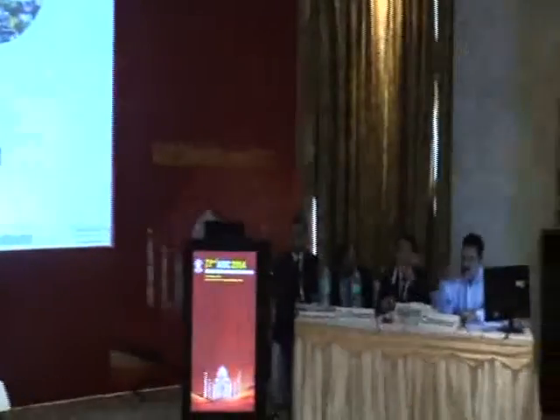Thank you. Do you have any opacification between the two lenses? No, sir. Opacification was seen mostly in cases where both IOLs were implanted in the bag. But the Sulcoflex IOL is a piggyback lens that's implanted in the sulcus. So if at all, the primary IOL might have a posterior capsular opacity, but there is no chance of an interlenticular opacification due to the design of the IOL itself. Can you use YAG then and clear it up? If it is interlenticular, unlikely, I would think. But posterior capsular opacification for the primary monofocal IOL, yes, definitely it can be done.